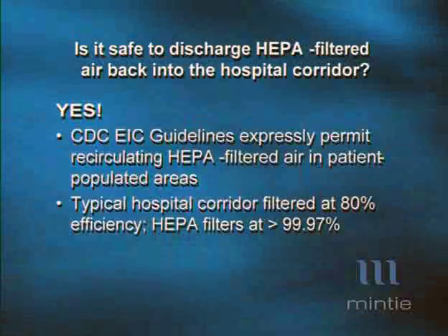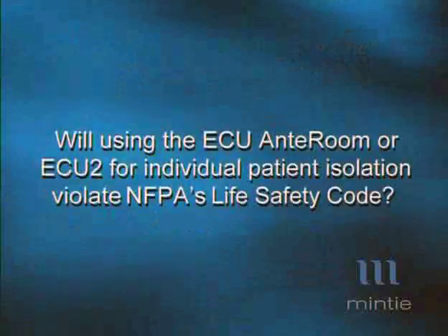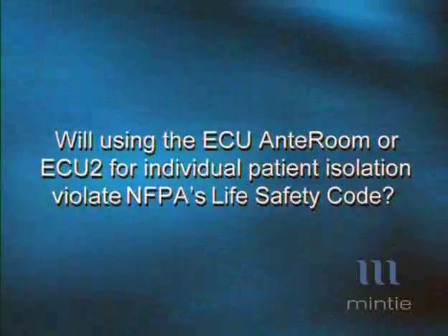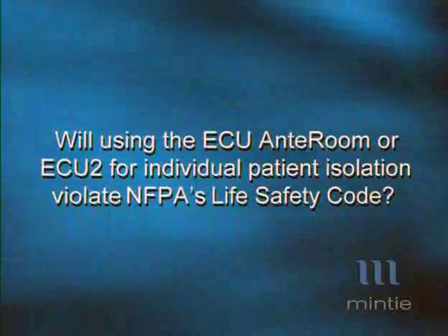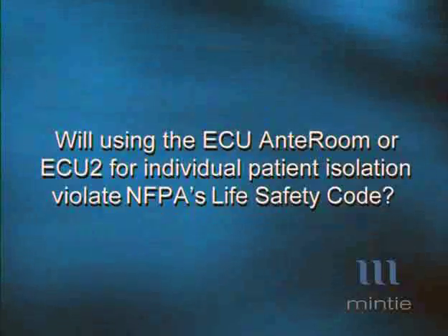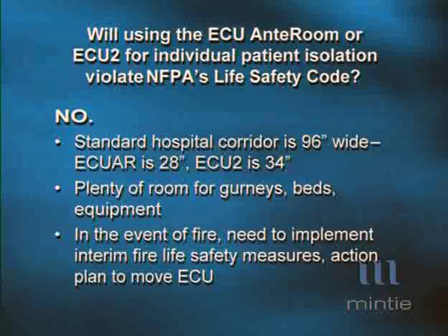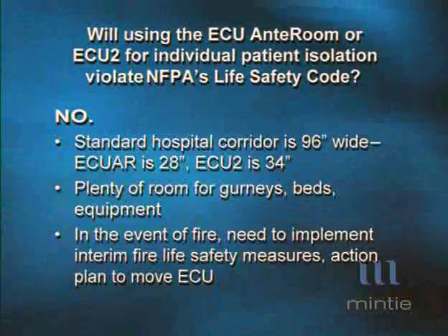Will using the ECU anteroom or ECU2 for individual patient isolation violate the NFPA's Life Safety Code referenced by the Joint Commission and Centers for Medicare and Medicaid Services? No, the Life Safety Code deals with permanent installations, and the ECU anteroom and ECU2 are temporary solutions for use in an emergency or for infection control purposes.